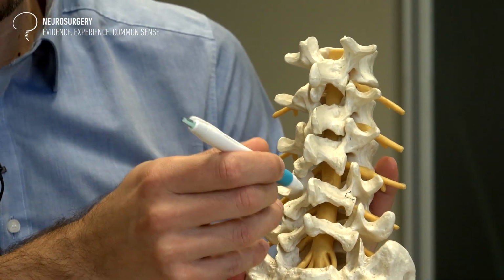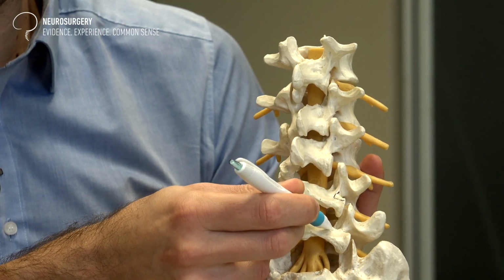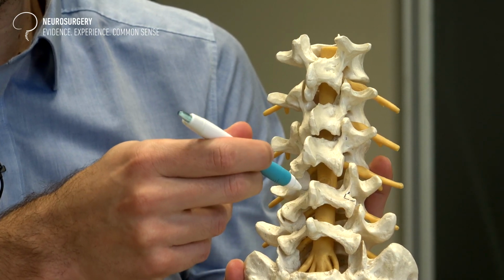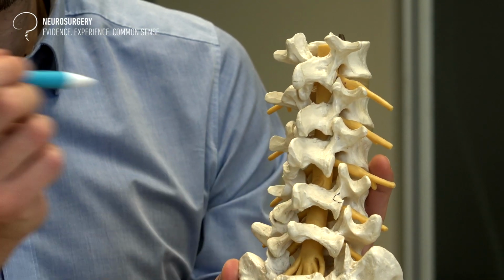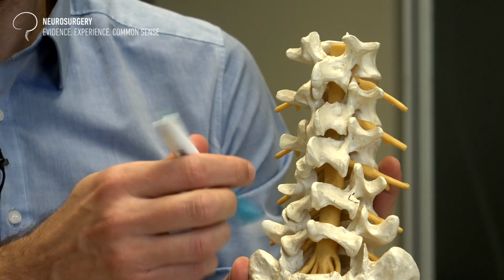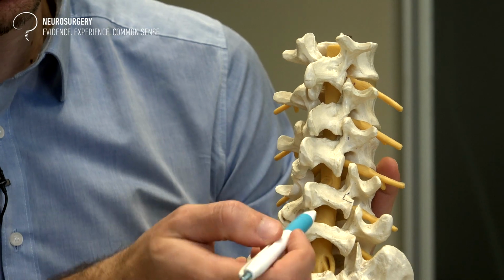That means we need to make a small incision just above the L4 and L5 interspace. We do an X-ray just before the incision to be sure that we are actually above the L4 and L5 interspace. We make an incision, and we retract the muscles from the spine on the affected side, which is the right side in this particular case.